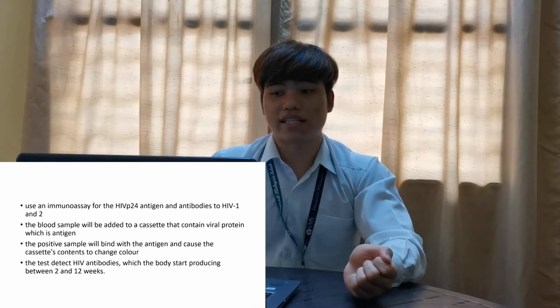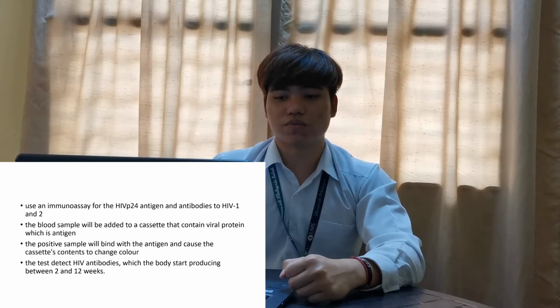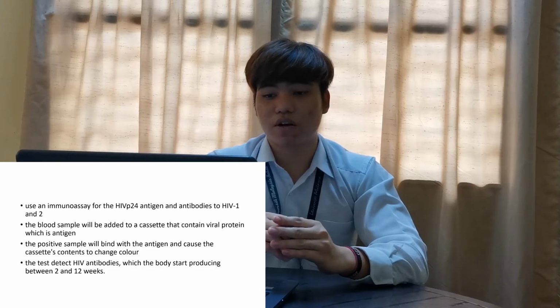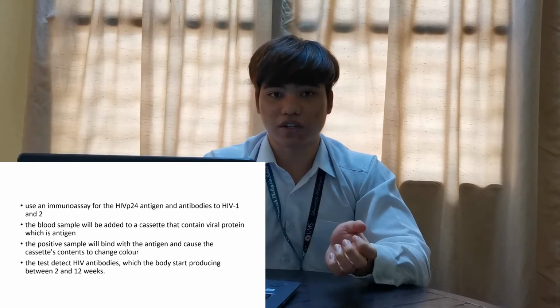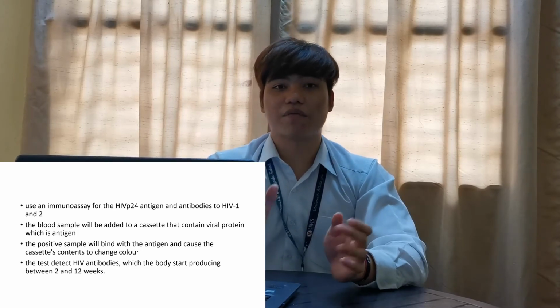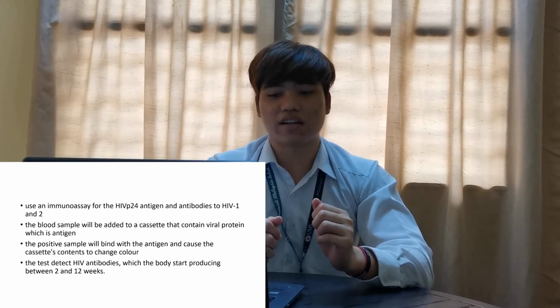The experiment used immunoassays for HIV p24 antigens and antibodies to HIV-1 and 2. The blood sample is added to cassettes that contain the viral protein, which is the antigen, that will be complementary with the antibody at the surface of the cassettes. The positive sample that has the complementary antigen and antibody will bind and cause the cassette contents to change color.